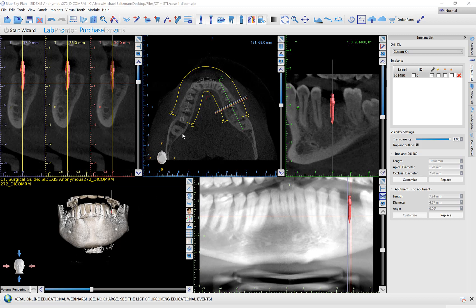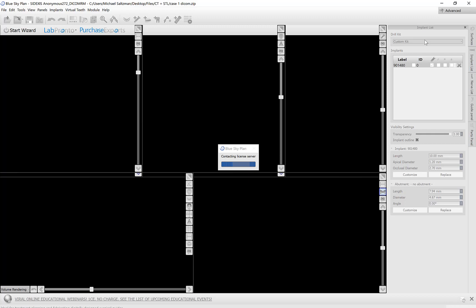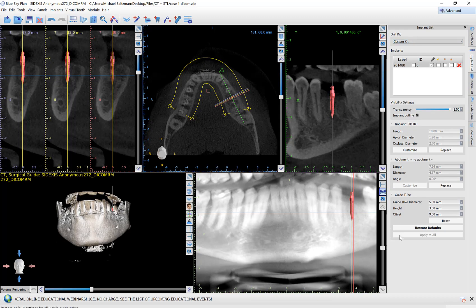So now let's discuss what custom kit really is. Right now I'm operating in normal mode, which means the software can be used without the user having to do any calculations or having to know any of the offset, guide hole diameter, or anything — the software provides all that information. But you are able to switch to advanced mode, which gives you more fields.